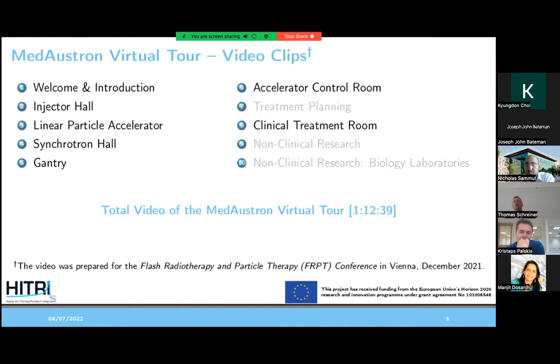There is one already realized in Germany at the Heidelberg Ion Beam Therapy Center. And I think the weight of this carbon ion gantry is about 600 tons. So we already have a large device, but this is even much, much larger. Therefore we decided to build just this proton gantry.